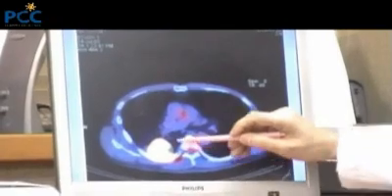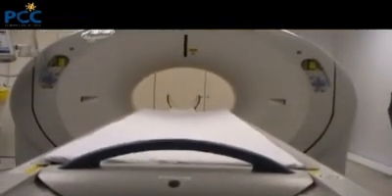In this situation, you can see a very large tumor in the right lung, and after the chemotherapy, you can see that the lesion has shrunken significantly in size. The advantage of approaching it in this manner is, number one, as I said, to downsize the tumor. Number two, to establish the effectiveness of the chemotherapy. And so the PET scan is very useful, as you can see.